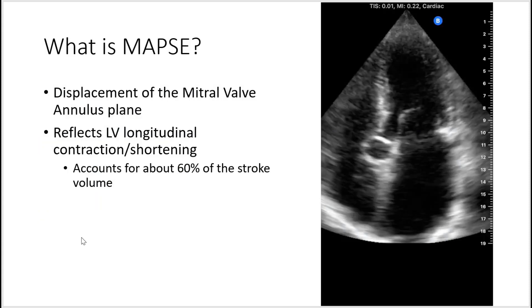What is MAPSE? MAPSE is the displacement of the mitral valve annulus plane, and this reflects the LV longitudinal contraction during systole, which itself accounts for about 60% of the stroke volume.